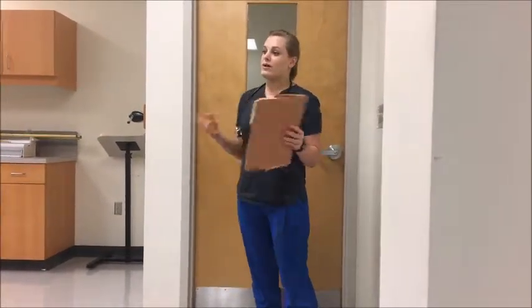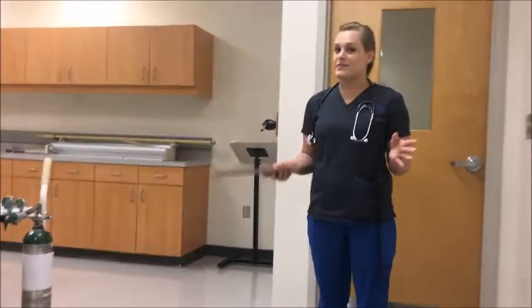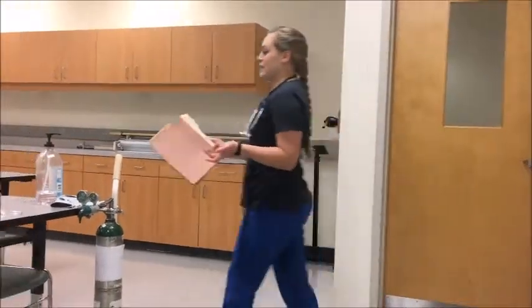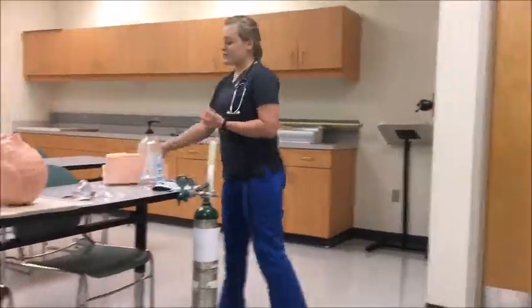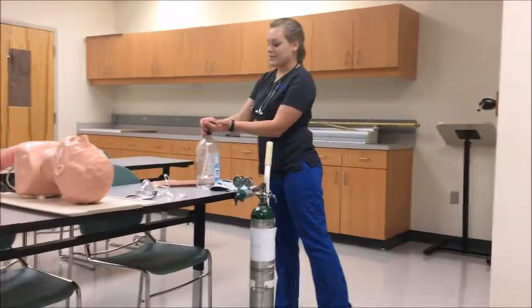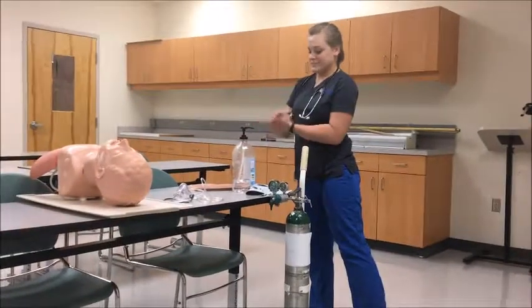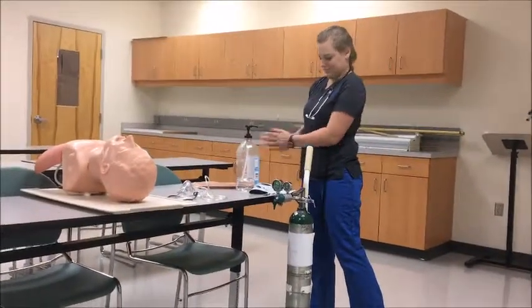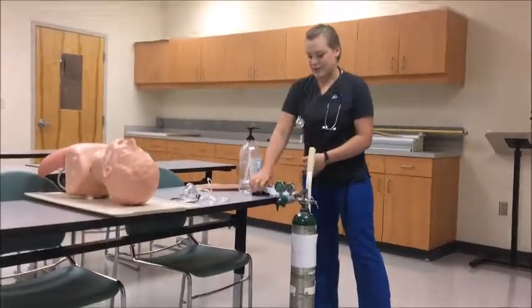So after you confirm the patient's chart and confirm the patient, you knock on the door, walk in, and introduce yourself. Hi, I'm Ksenia from Respiratory. While doing this, you're washing your hands or using hand sanitizer and putting on your gloves.